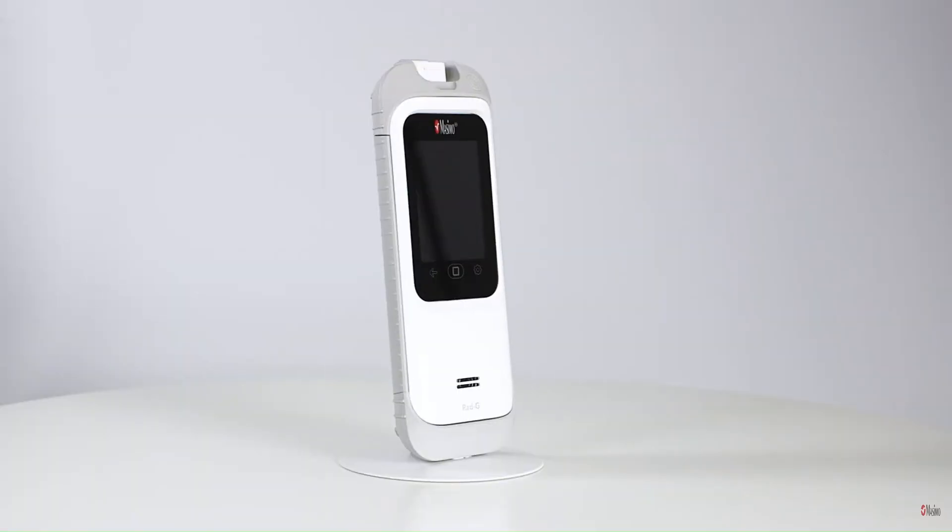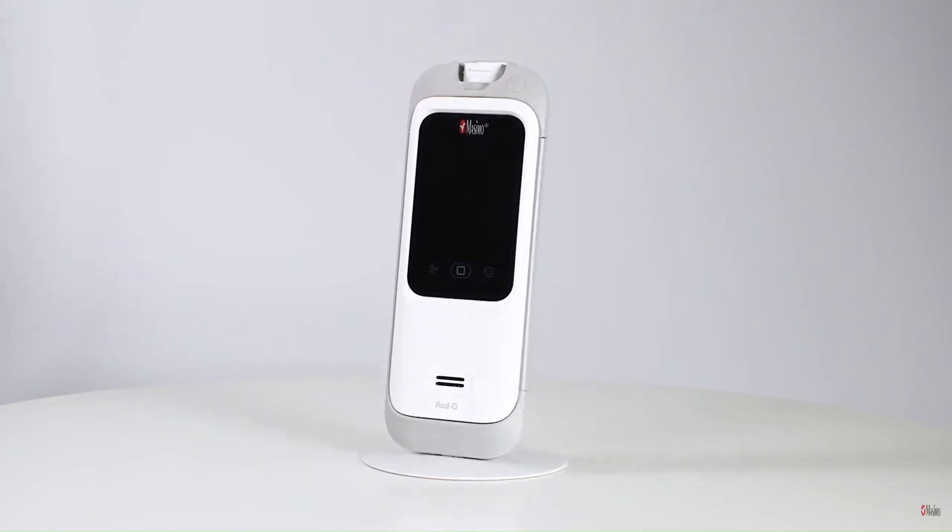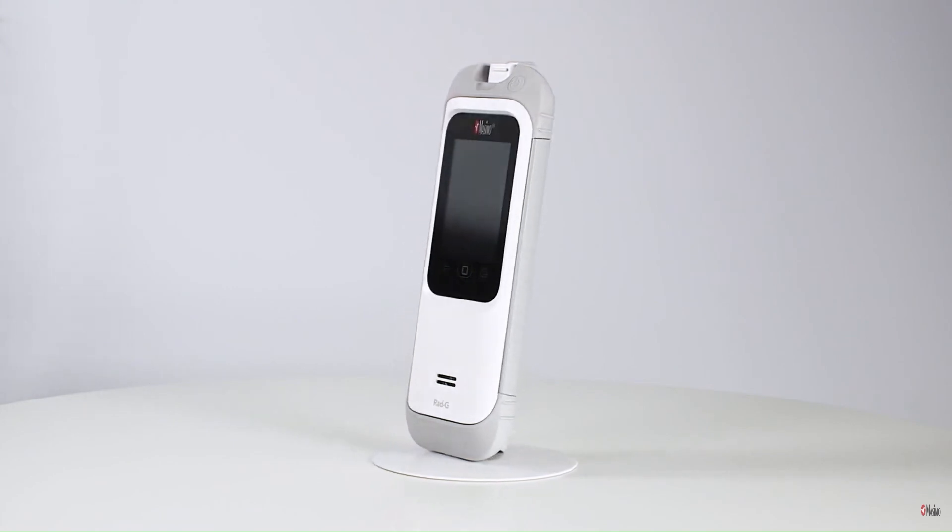This concludes the training for the RadG pulse oximeter. For more information, please refer to the RadG operator's manual.